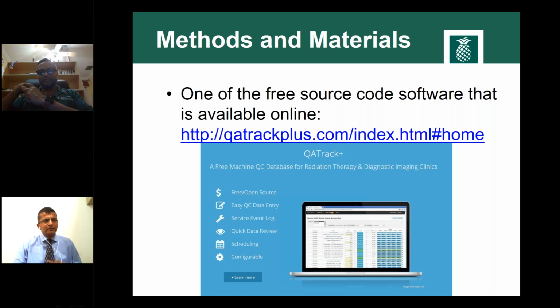Actually, vendor software is a configurable tool for putting in what you want. Whatever TG requirements, like TG66, TG148, TG135, TG275, the physics group or the physicist in charge has to read through that and understand the need of that specifically according to TG100. The physicist is the person who is in charge of the QA program. So we evaluate all that, discuss it in our group, and then we incorporate the tests into the software. We don't really depend on the software to spit out the tests that are necessary for us. The physicists decide this test should be done for our program, and then we incorporate the test into the software, which will remind us, okay, this is the time to do it.